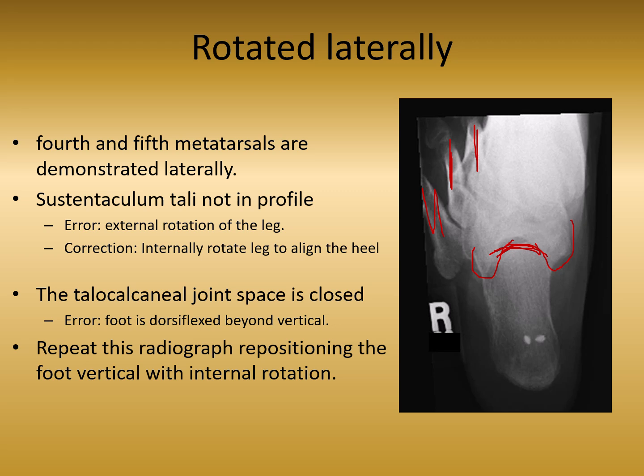And we have to internally rotate the foot to take away that rotation, because that sustentaculum tali is being superimposed, and it's not in profile anymore. And the trochlea too, right? That trochlear process is not really being seen very clearly either. Even the medial and the lateral processes are not clearly demonstrated here. So quite a few issues to deal with on that specific x-ray for repeating it.